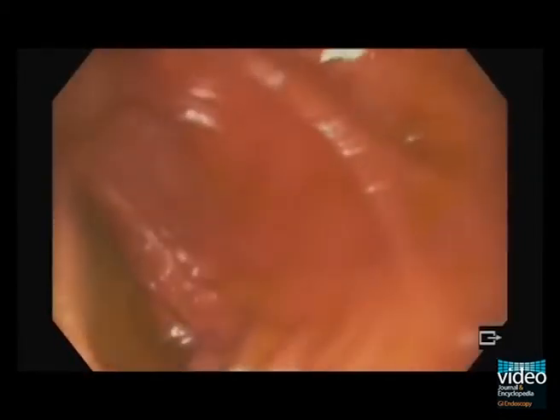The terminal ileum is reached by intubation of the ileocecal valve between the superior and inferior valve lips. The terminal ileal surface appears granular in air, but the villi will float up underwater.